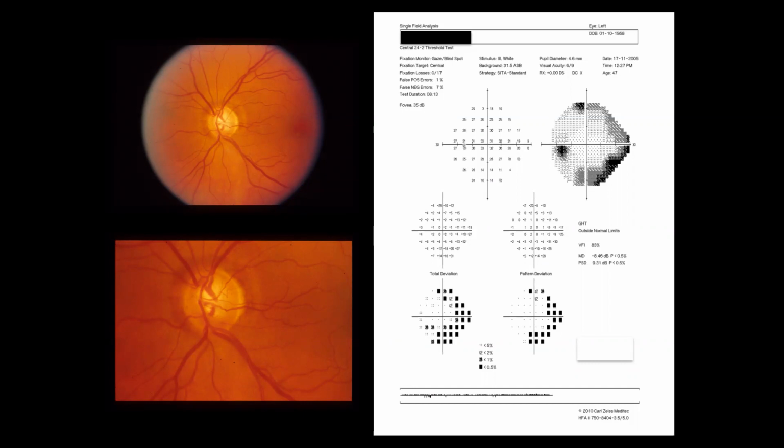And what about false negative? It's when you put a stimulus on the patient and you decrease it and you repeat it again and he's not responding to it. So you are giving him a brighter stimulus. Yes. And the patient is not seeing it on the same site in which he saw before a dimmer stimulus.